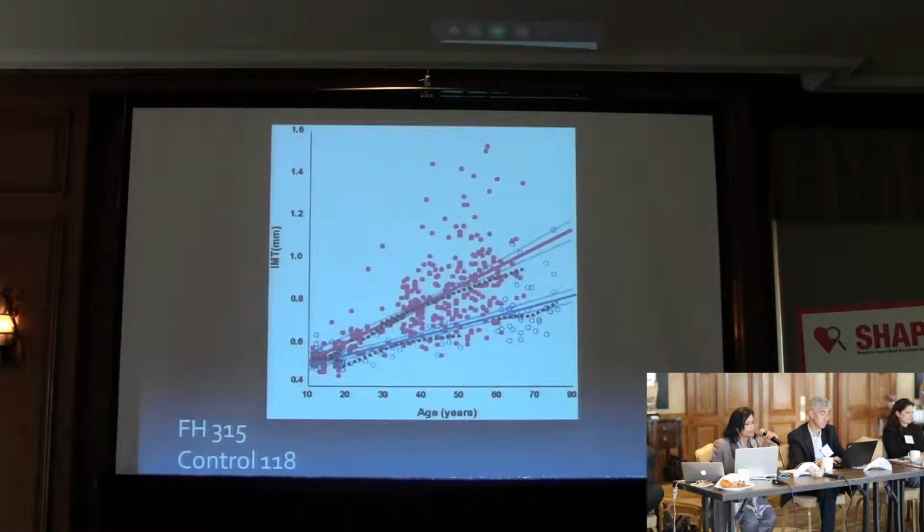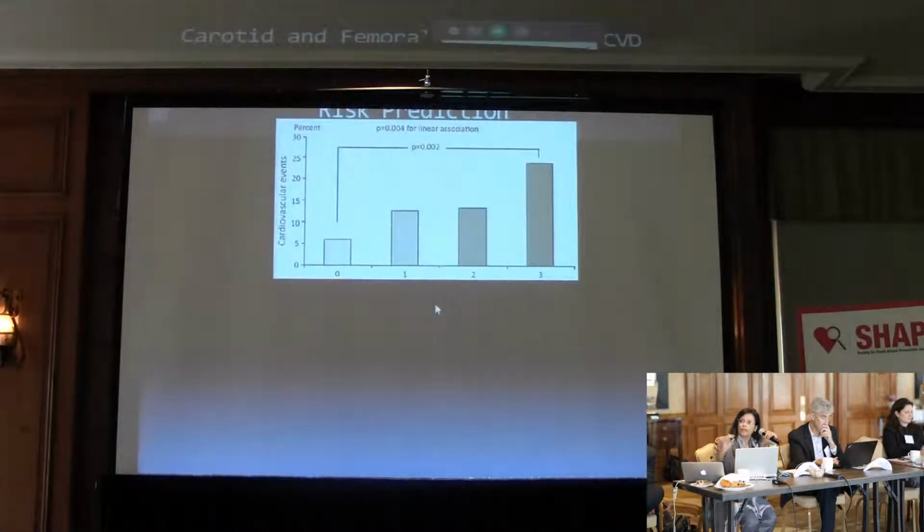So this is a test that actually can be applied to a younger population, let alone later age years. Now this is a study in about 500 men, all were 58 years old, this is just the nature of their enrollment, who had various degrees of insulin resistance and BMI, who underwent only plaque imaging, no IMT, of the bilateral carotids and one femoral side, so three vascular beds.